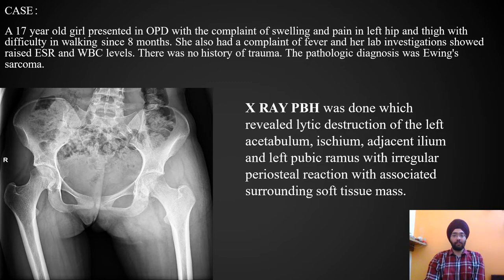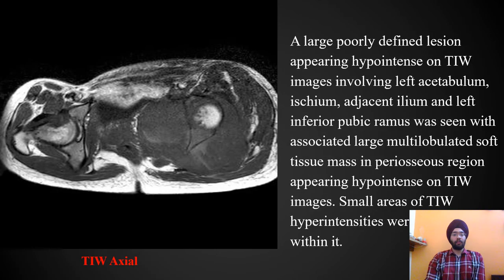On X-ray of bilateral hip joints, a lytic lesion is seen in the left acetabulum, ischium, adjacent ilium, and left pubic ramus with irregular periosteal reaction and associated soft tissue mass. On T1-weighted axial images, a large poorly defined lesion appearing hypointense on T1 involving the left acetabulum, ischium, adjacent ilium, and left inferior pubic ramus is seen, with associated multi-lobulated soft tissue mass. Small areas of T1 hyperintensity were seen within it.